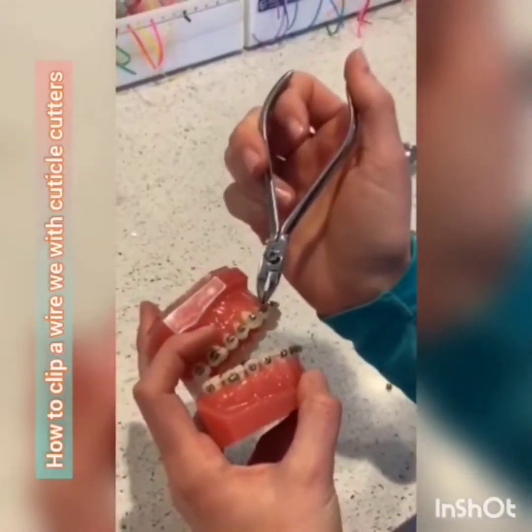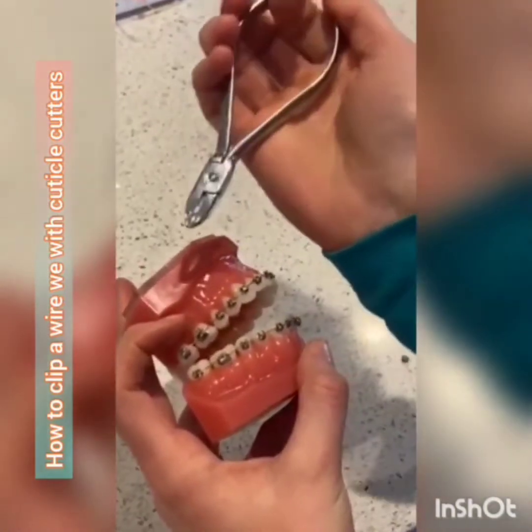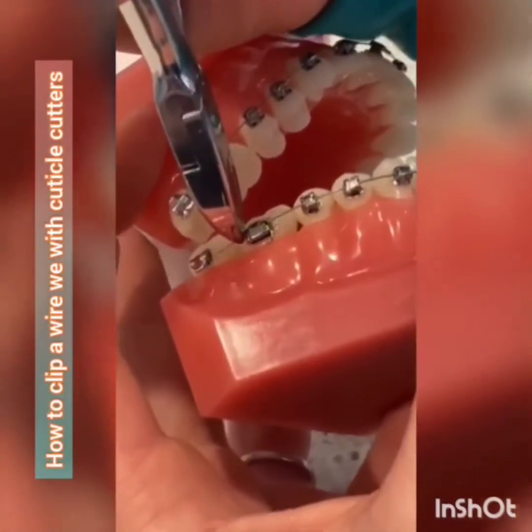Alright, so same problem. If you have a pokey wire, you can also use these cuticle cutters. Make sure to use the flat end so you can get as flush as you can against the bracket. You're going to put it as close as you can and snip. Alright, so very important reminder, if you do clip your wires, make sure that you take tweezers and remove any loose wire from your cheeks or your mouth.